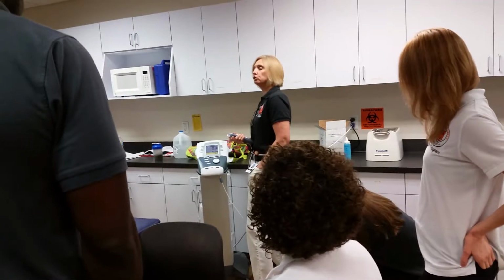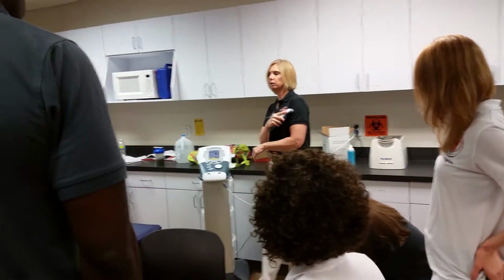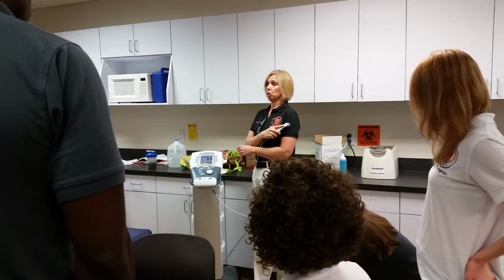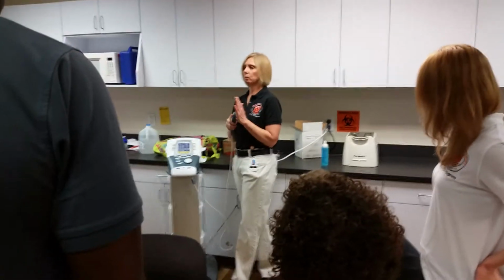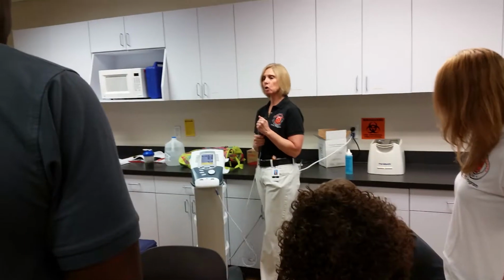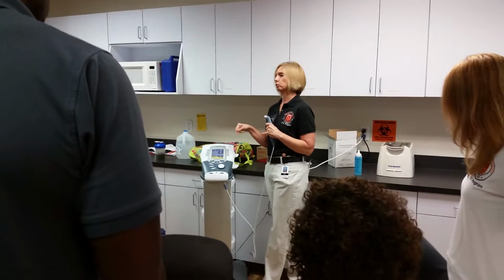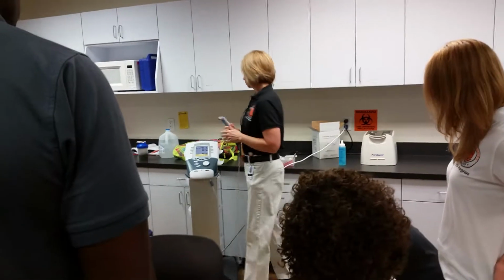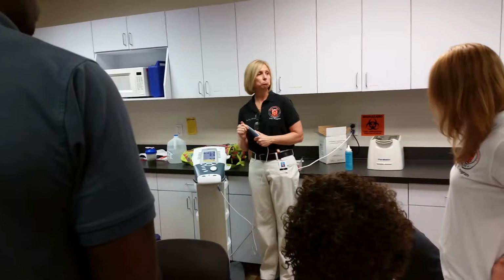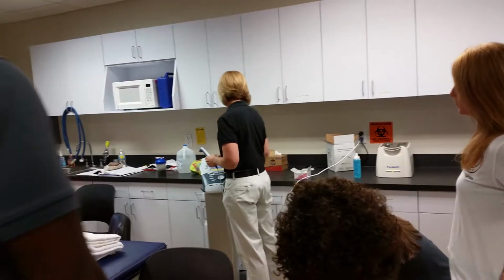So when you're in clinic, you can use that. It just basically warms the sound head because when you put the gel on someone, unless you have a gel warmer, it feels really cold. And when you start the ultrasound treatment, it'll feel really cold. So the head warmer just kind of takes a little of the edge off of it. But if you're using the head warmer, I can't tell if you get to the right level because the person's already feeling heat. Okay. So it has nothing to do with the thermal? No. This is just physically warming the head. So you want to make sure that's turned off.